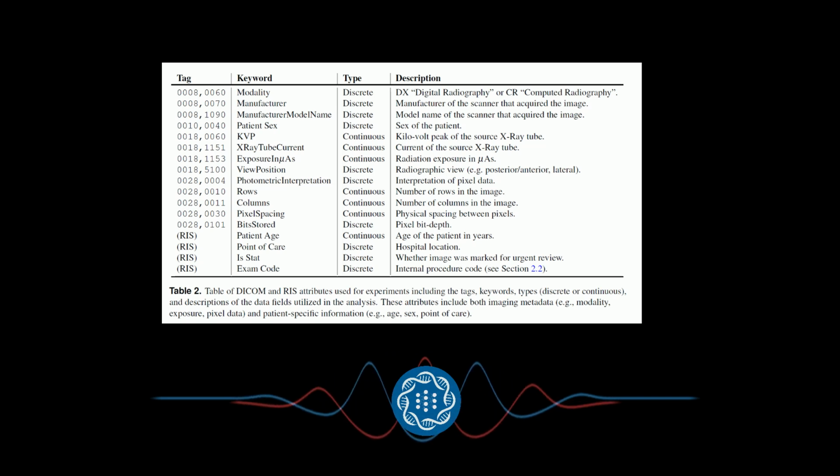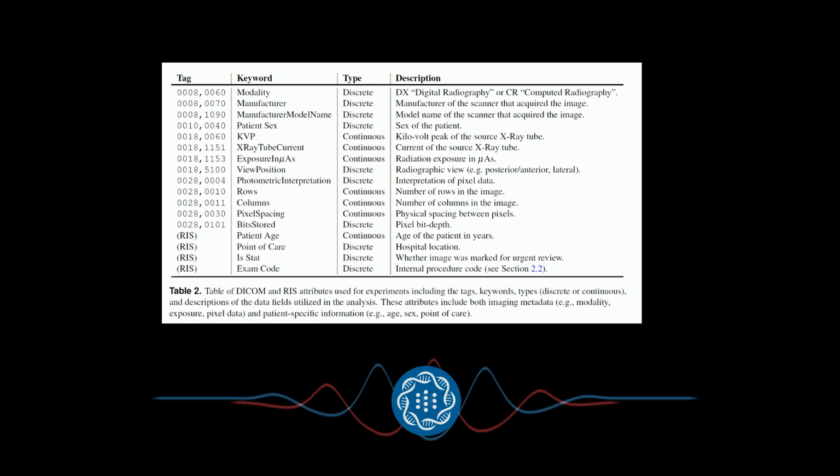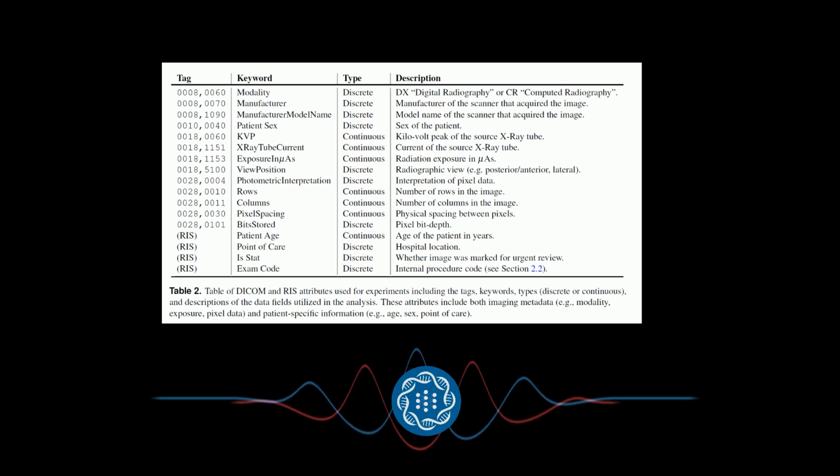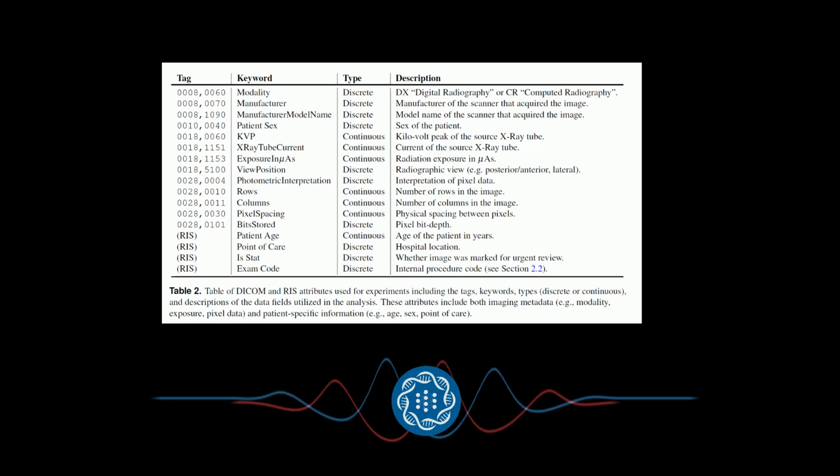Oh, right. Metadata. So that's basically all the extra information that's attached to an image, right? The date it was taken, what kind of machine they used, that kind of thing. Exactly. It's all those little details. And you might think, well, who cares about that stuff? But it's actually really important for understanding this whole drift thing.